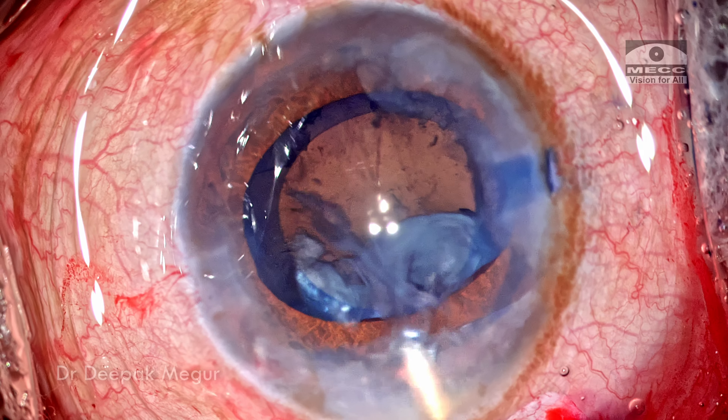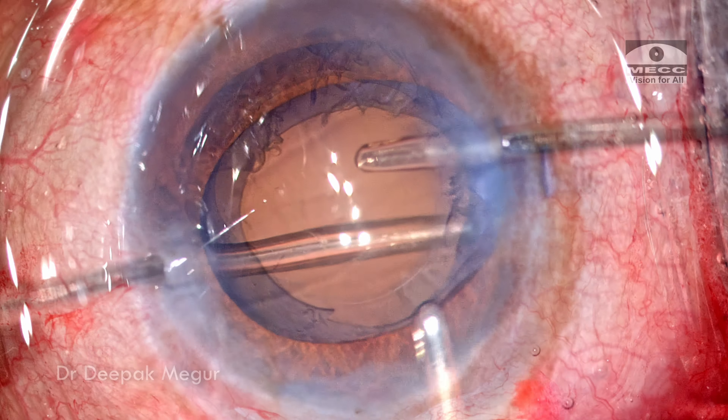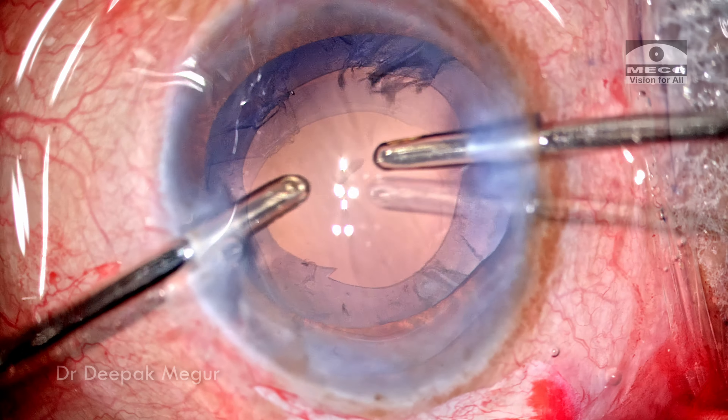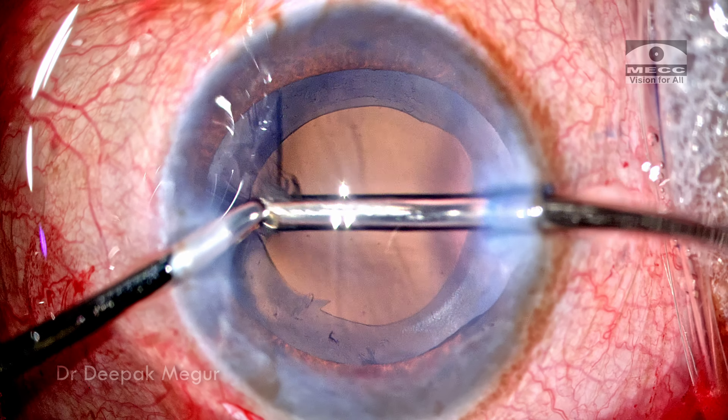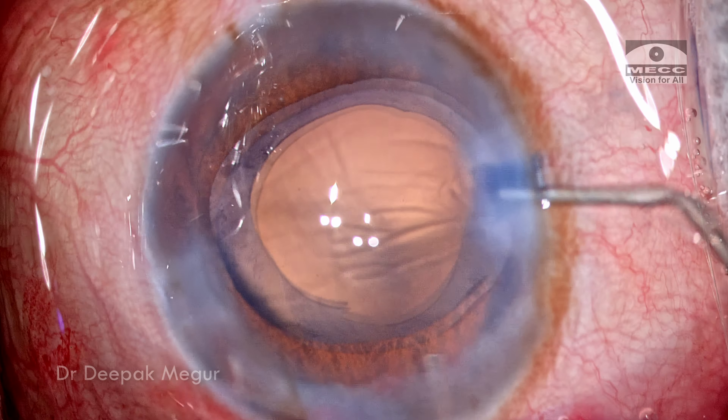Using the irrigation cannula I'm trying to burp out some of the free cortex. Bimanual I&A is used to perform the cortex aspiration. The posterior capsule is polished with BSS.